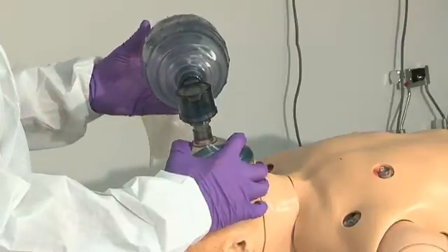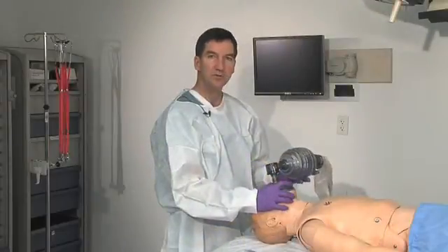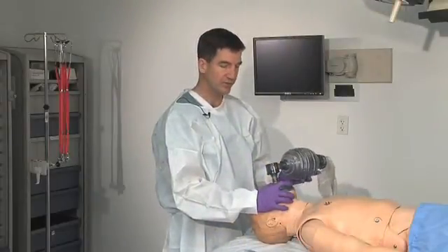I have my mask, I have my bag, and the oxygen supply is attached. I start with deep, slow, full respirations.